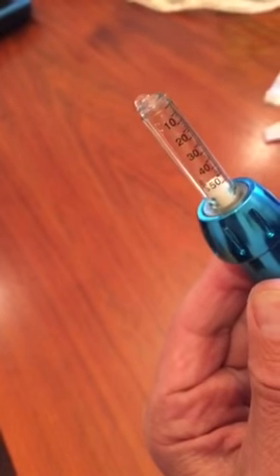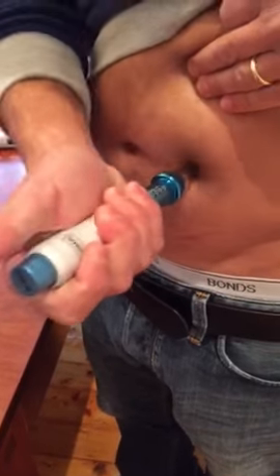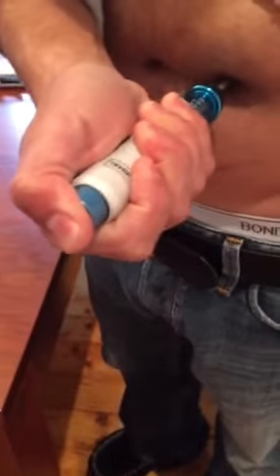The excess liquid coming out means the hammer sits right on the plunger. Place it against the skin at 90 degrees, indent it, and release the button.